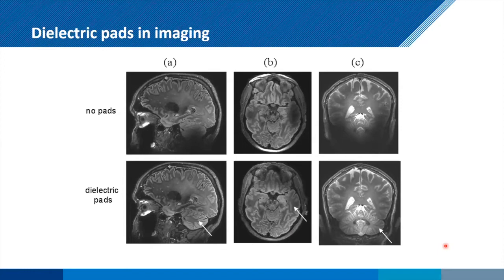And it's interesting, actually, now, as you know, the Siemens Terra is the first FDA-approved scanner, and they actually ship out these dielectric pads with the Terra. But of course, as your group knows, this is not a complete solution.